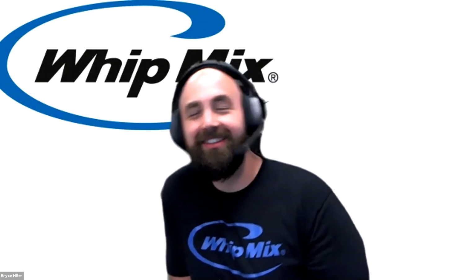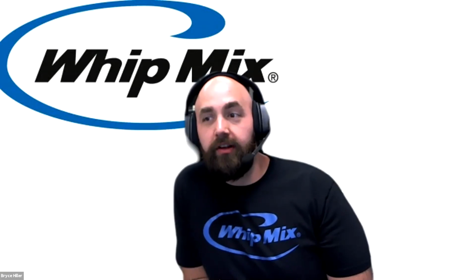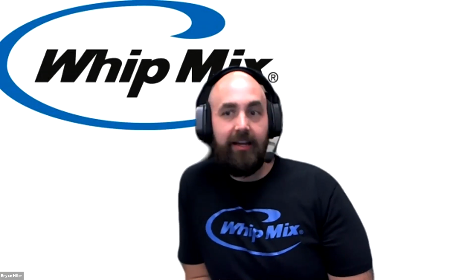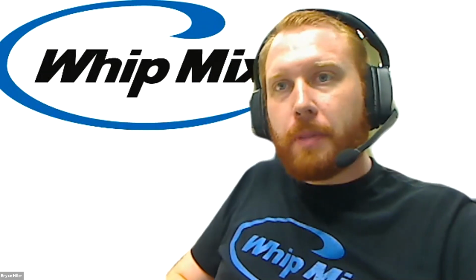RPD 101. Yep. So what are we doing tomorrow then? We're going to do flexible RPDs. So it's going to be that next step for creating the Valplast style RPD frameworks. Awesome.